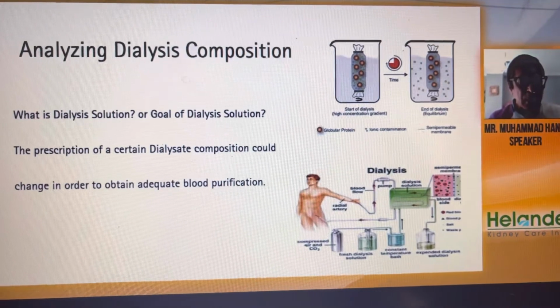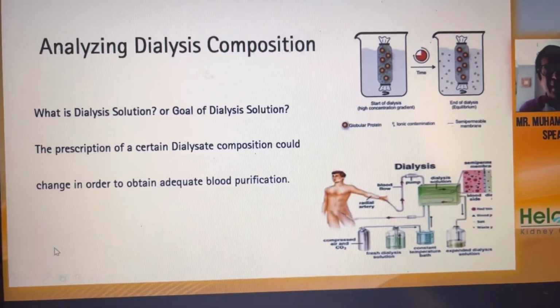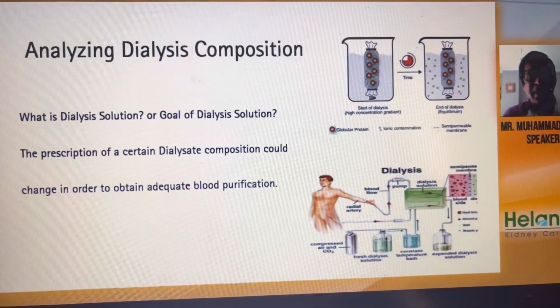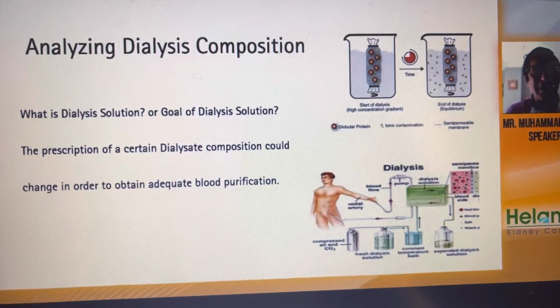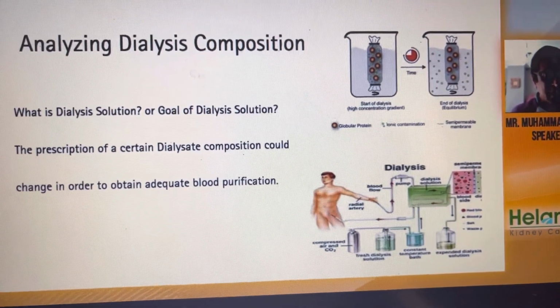First of all, we need to understand what is dialysis. Why do we have to understand the dialysis composition? What is the importance of the dialysis solution or dialysis composition while we are doing the dialysis?